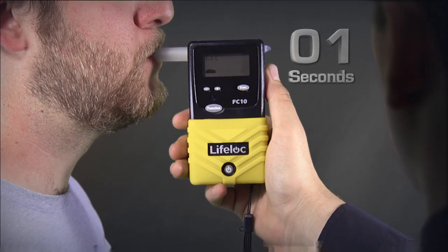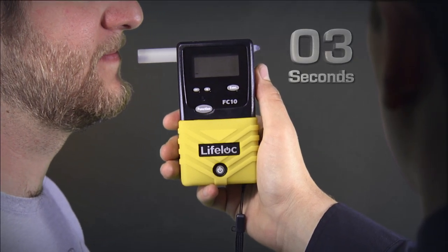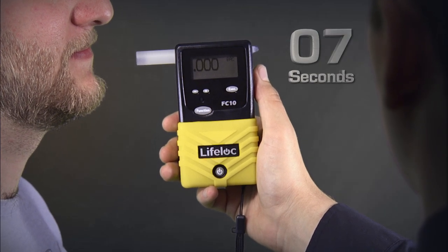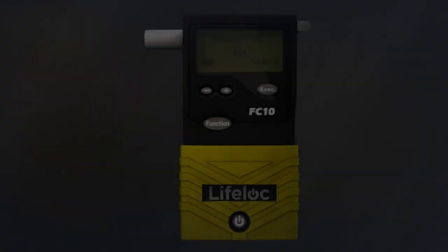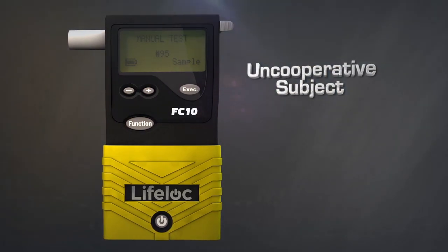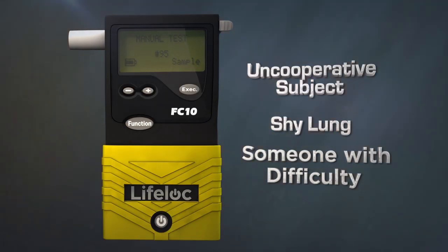An entire test sequence takes less than 10 seconds. Manual testing is used in cases involving an uncooperative subject, shy lung, or someone with difficulty providing a full breath sample.